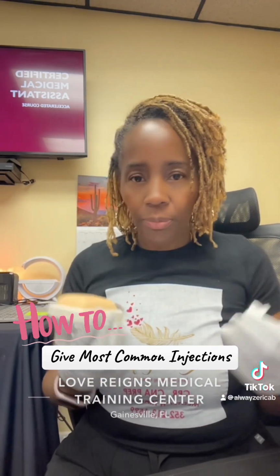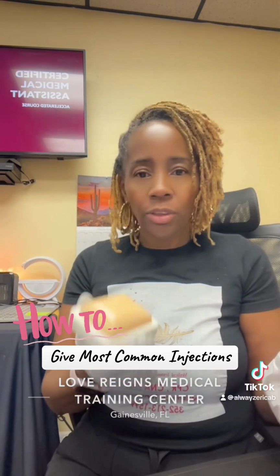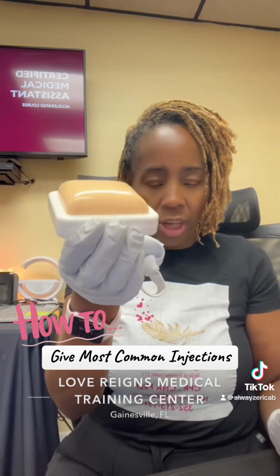If I was doing this at home, I don't need gloves, okay? But in the medical field, in the medical setting, you should be having gloves. You should have on gloves when you get ready to do the alcohol away from the site and let that air dry. You should already have on gloves, okay?